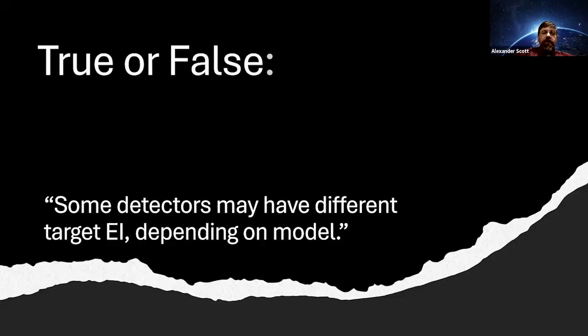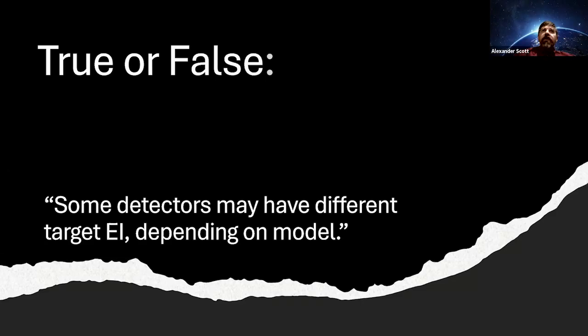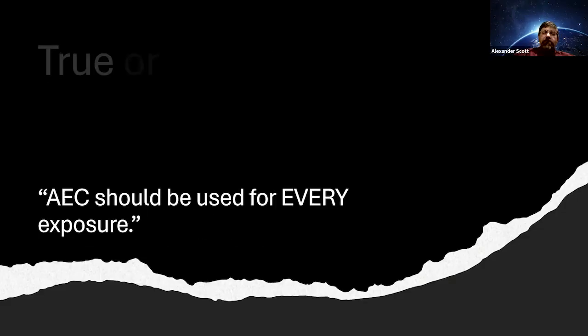All right. Who's going to tackle this one? Let's go with Sabrina Khan. I would say it's true. Okay, I agree. Sabrina, do you do digital radiography imaging? Yes. Do you know what your target EI is? I'm not sure. Okay. Sorry. Okay. Well, thank you. I appreciate it. You could have just said, "Oh yeah, it's 175," but it's a good question, and it varies from site to site.